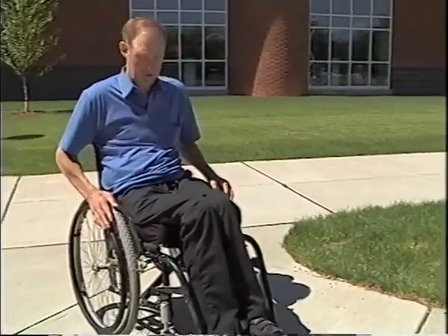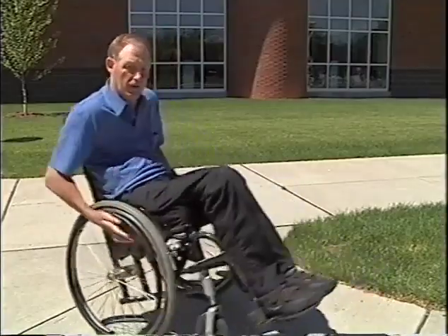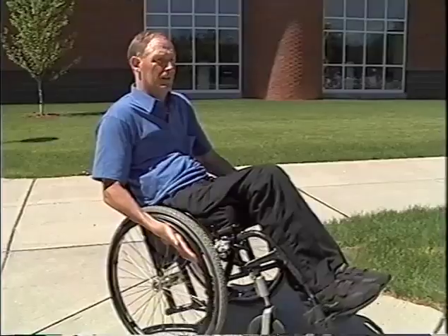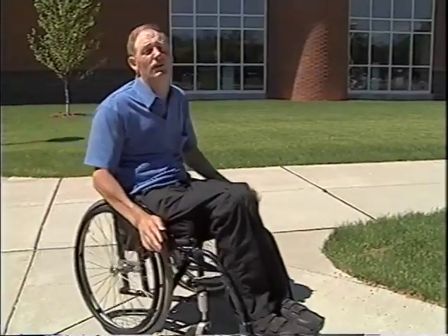Another important thing, if you do fall over backwards, please tuck your chin into your chest. We don't want you to hit the back of your head on the floor or whatever you're practicing on. And if you do start falling backwards, to save yourself, pull backwards. That will bring the chair down. It sounds wrong, but pulling backwards is the right way to save yourself.